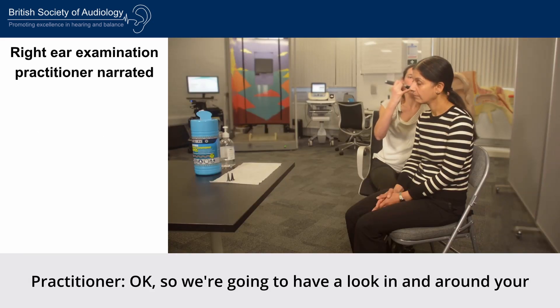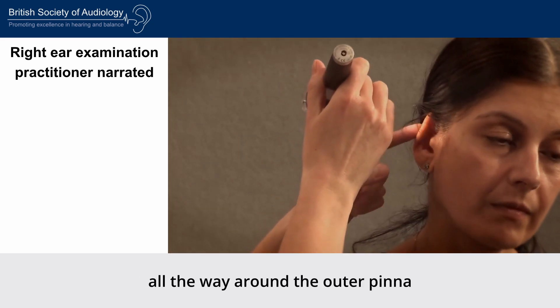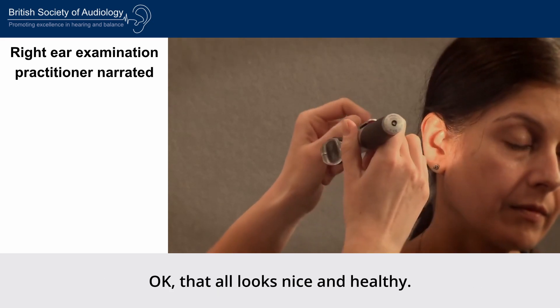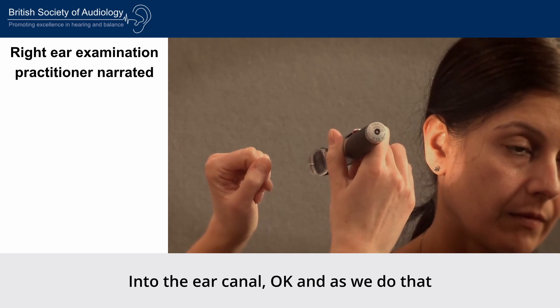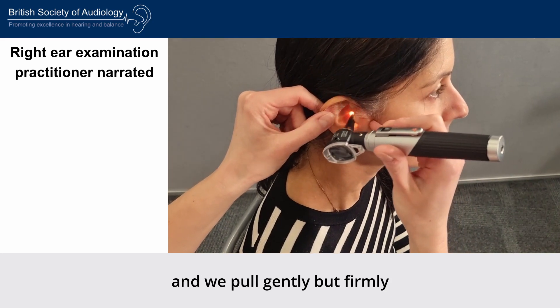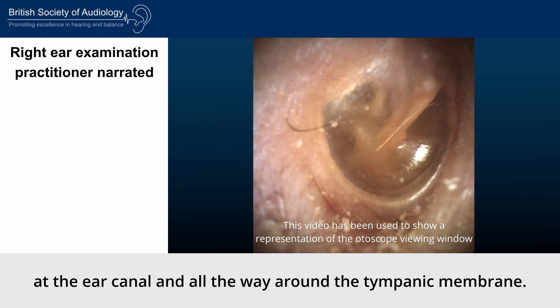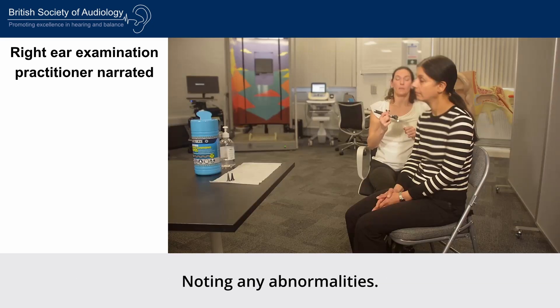We're going to have a look in and around your right ear now. We'll start by looking all the way around the outer pinna — all the way behind, underneath and back in front by the tragus. That all looks nice and healthy. We're now going to insert the speculum centrally into the ear canal. As we do that, the little finger comes out to brace and we pull gently but firmly up and back on the pinna with the left hand. Once we're in, we have a really good look at the ear canal and all the way around the tympanic membrane, noting any abnormalities.